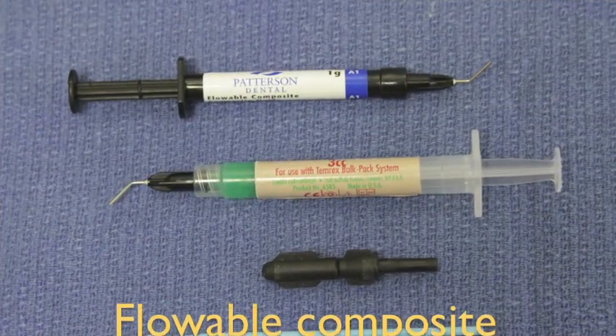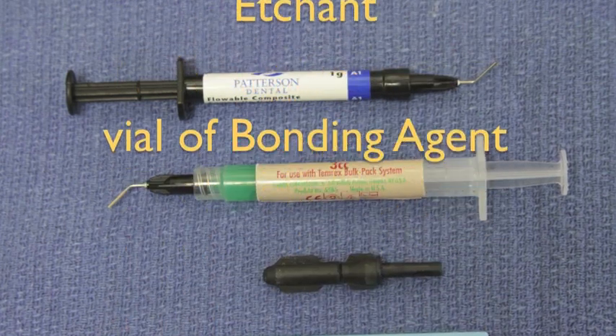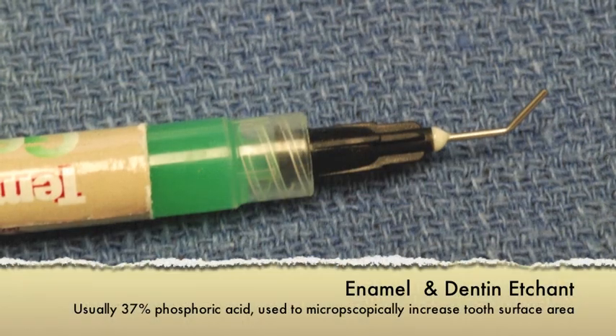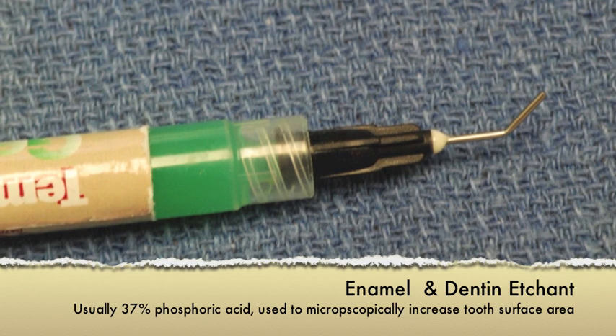In this picture you can see three materials: flowable composite, etchant, and bonding agent. Acid etchant, or etchant, is a gel that is usually about 35–37% phosphoric acid, whose function it is to microscopically erode the surface of the enamel and the dentin, thus increasing its surface area.